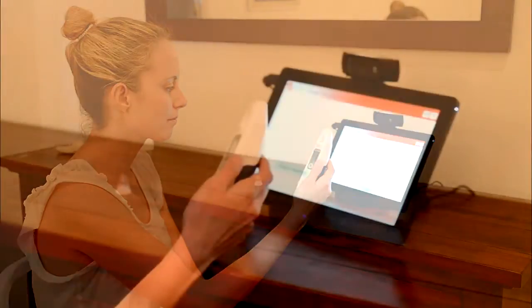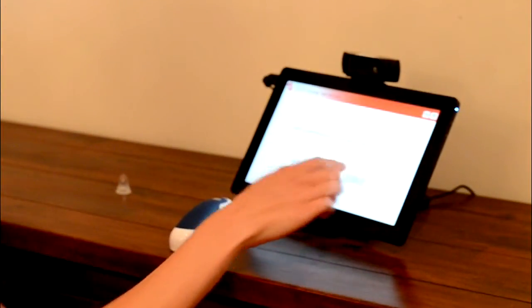Wait for the telehealth hub to announce the measurement, then press NEXT on the telehealth hub to continue.